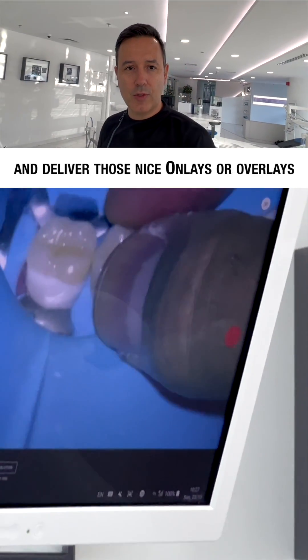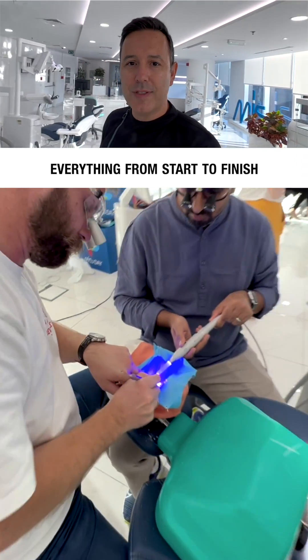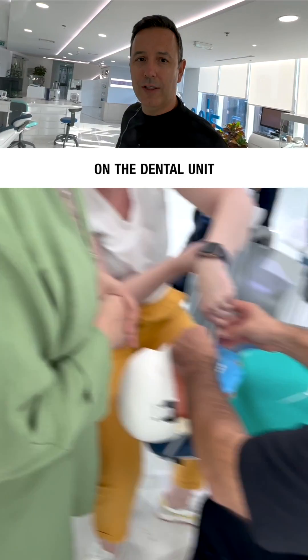Then we move back to the chairs and deliver those nice onlays or overlays with heated composite under absolute isolation. So in other words, everything from start to finish, done by yourself on the dental unit.